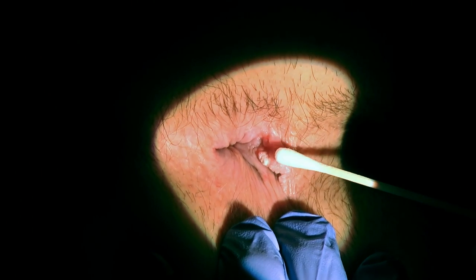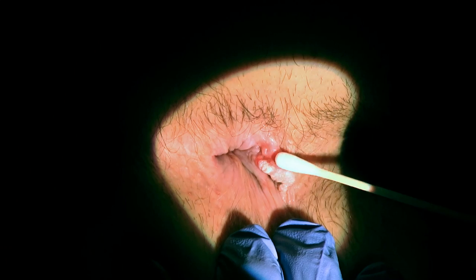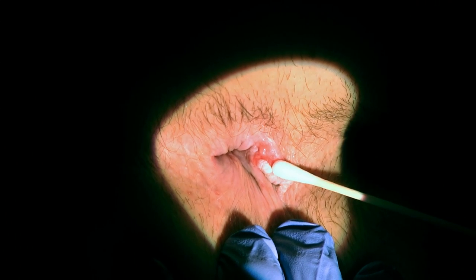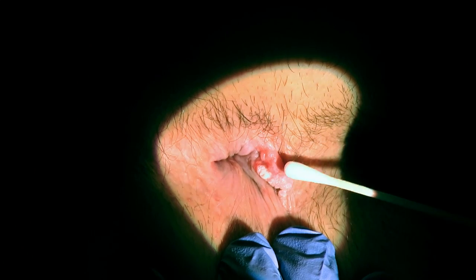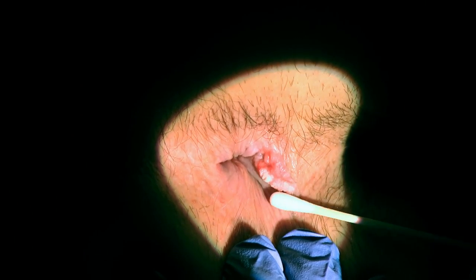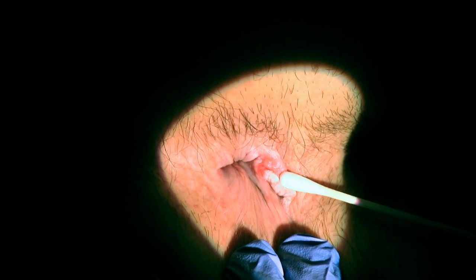On this occasion we're going to do a biopsy for two reasons: first, to investigate the area at the base of the wart which shows some erythema and possibly ulceration — which may be due to trauma — but we want to exclude a neoplastic event. We'll be taking an excisional biopsy. The base of the wart is quite substantial, so I probably won't be able to excise it all, but we'll certainly be able to remove the erythematous area.